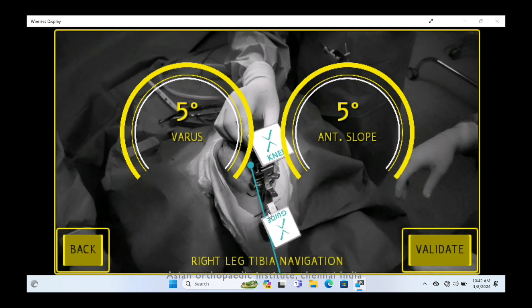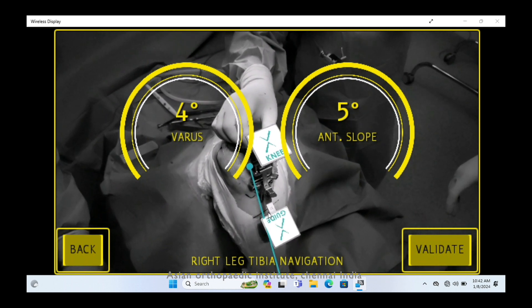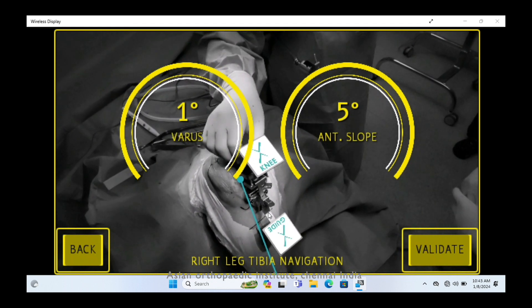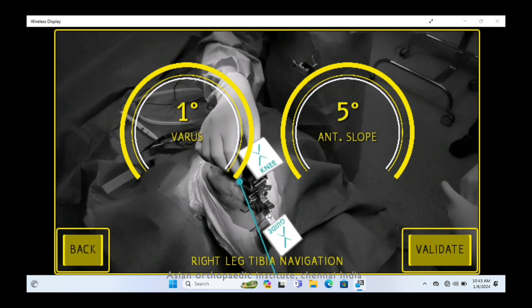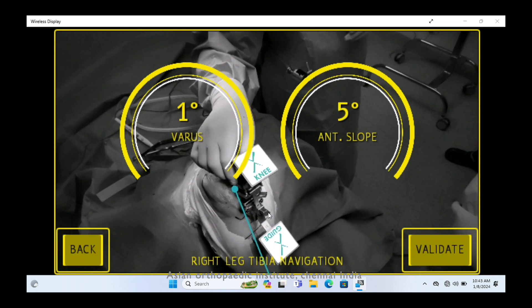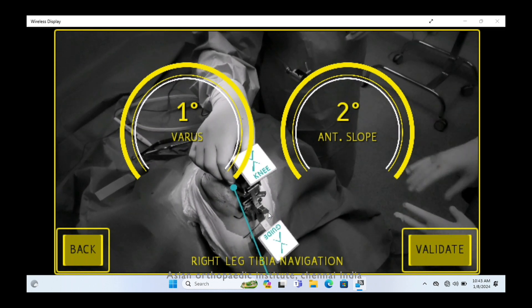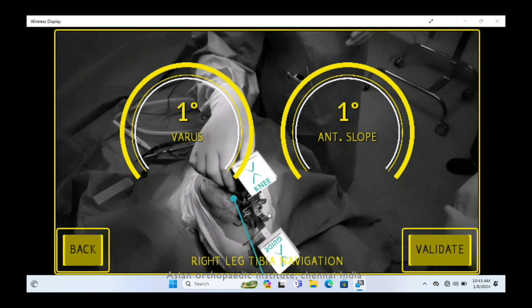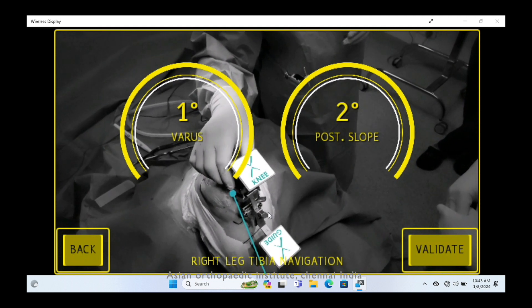Placing the cutting guide on the tibial jig, you can adjust while visualizing the cut plane surface in real time — varus and the desired slope required for that patient on the table. You can see the center of the tibia on the long leg axis. This is the power of augmented reality: precise and fine adjustment.